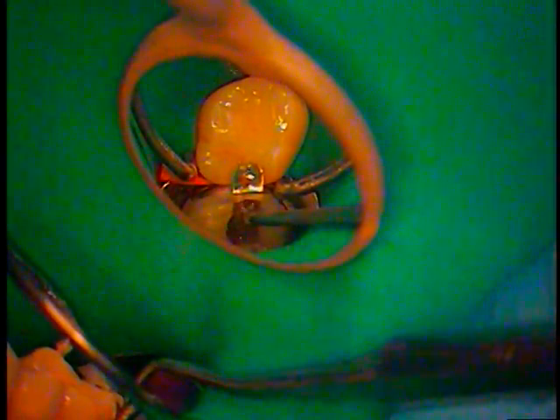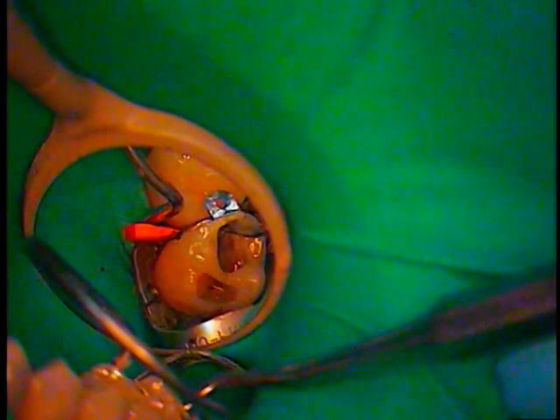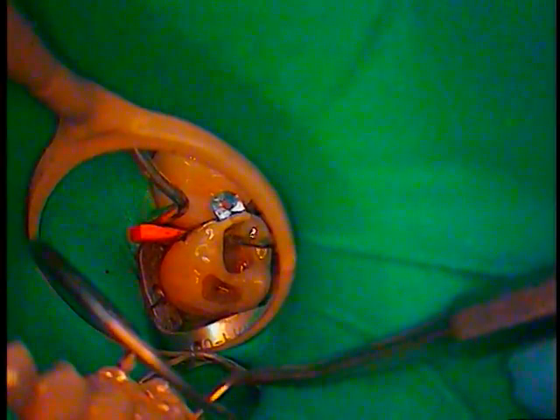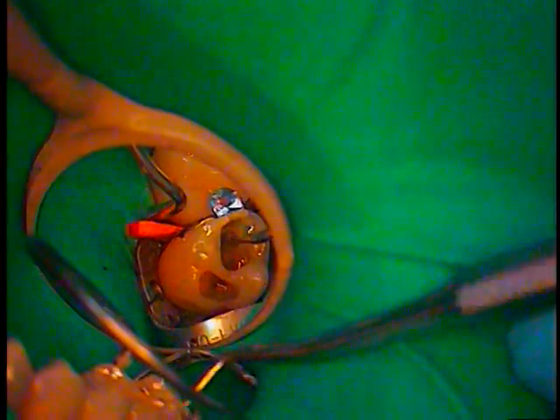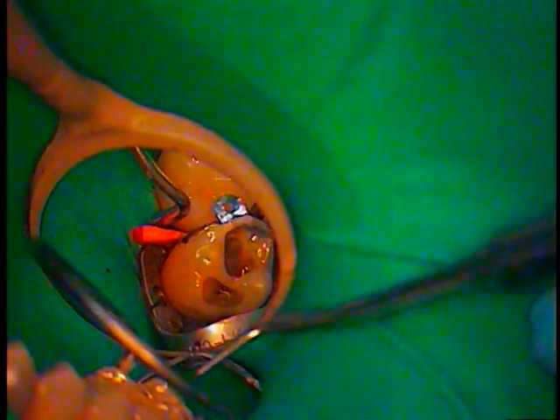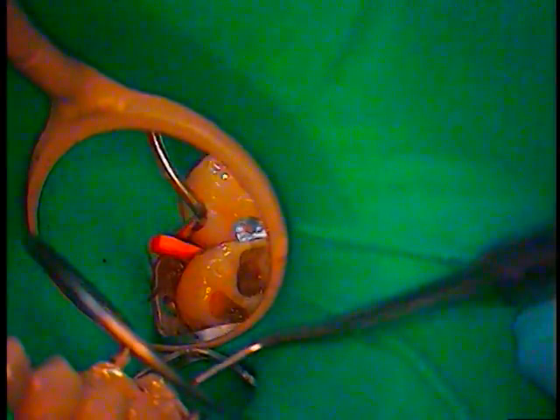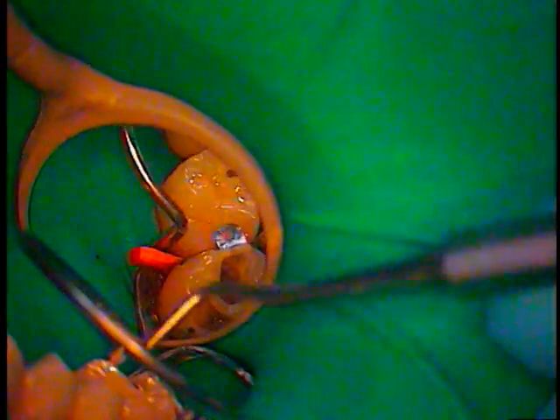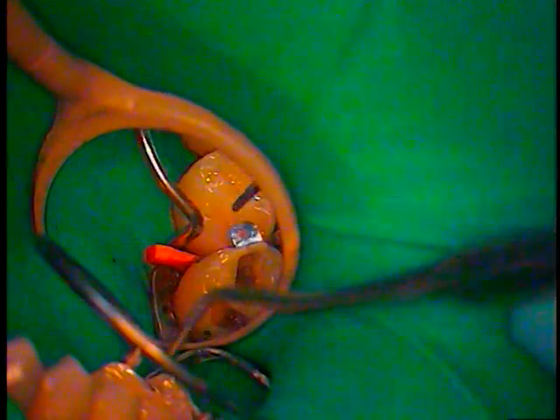Standing by. Oh yeah, we got a little breach here—we got a tear in our dam. Okay, we're still hanging in there. Everything's cool. My walls are built nicely. Let's get these guys done now.